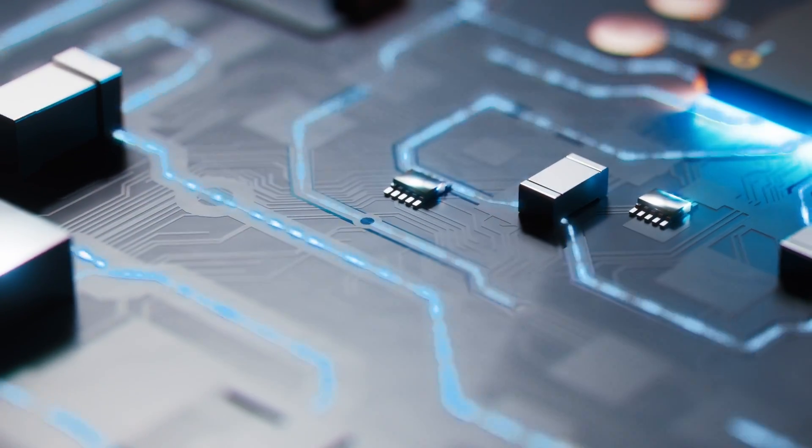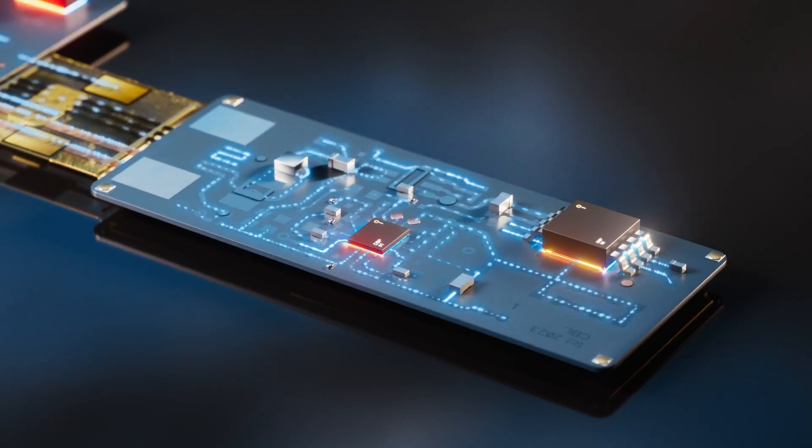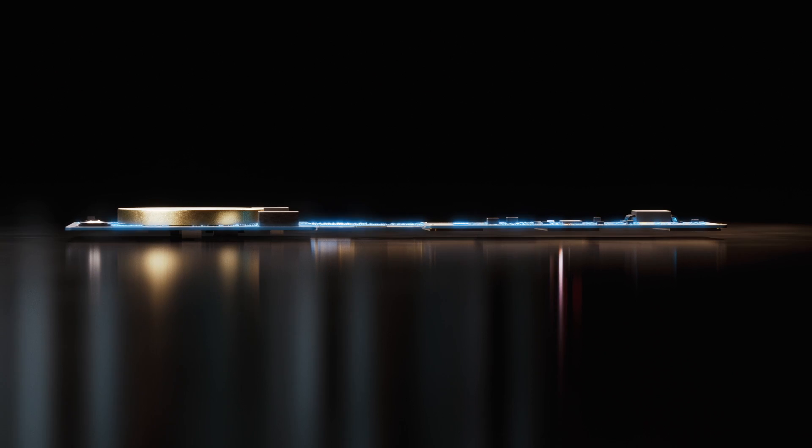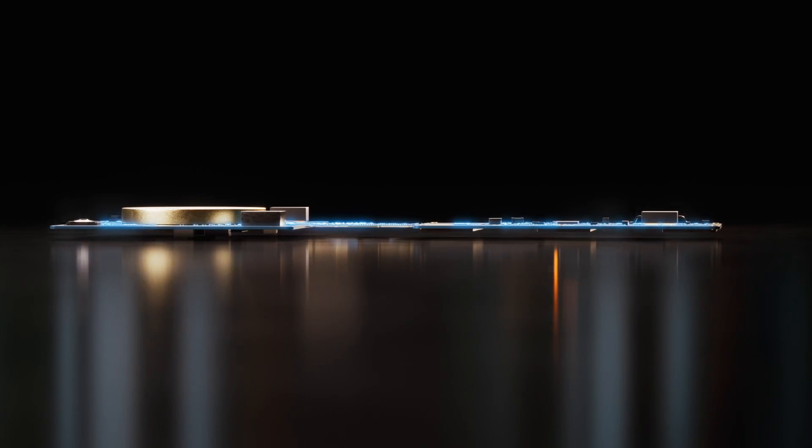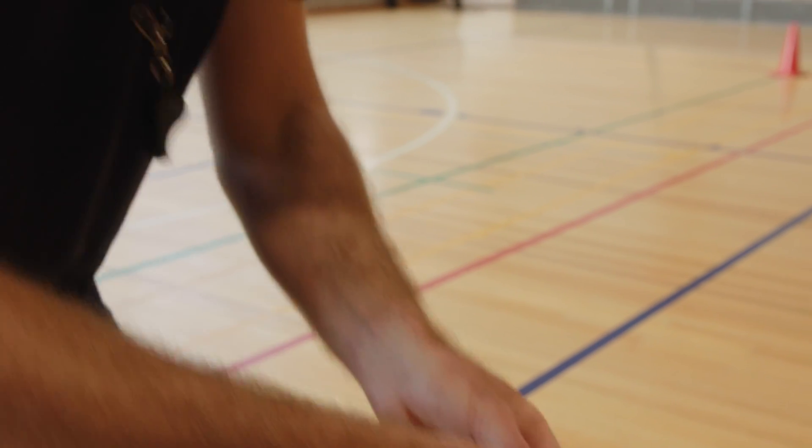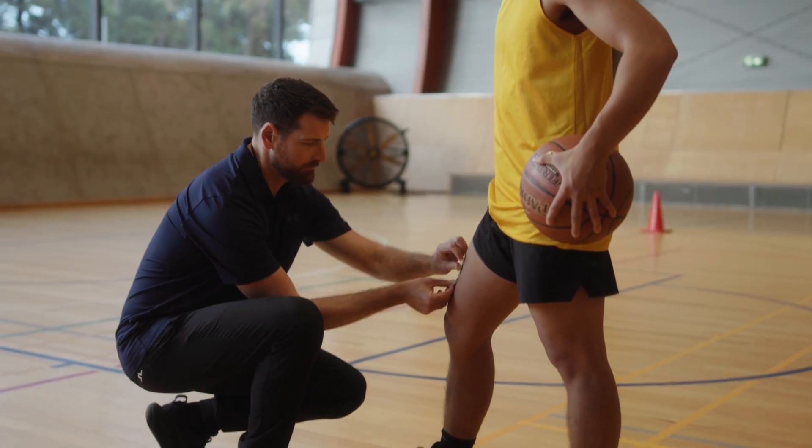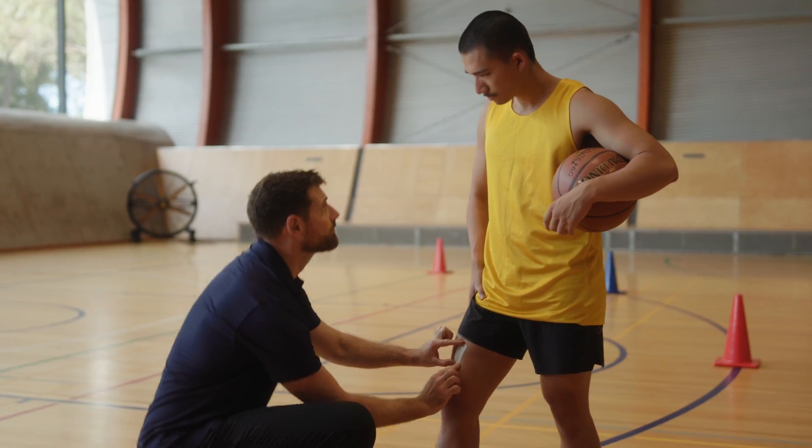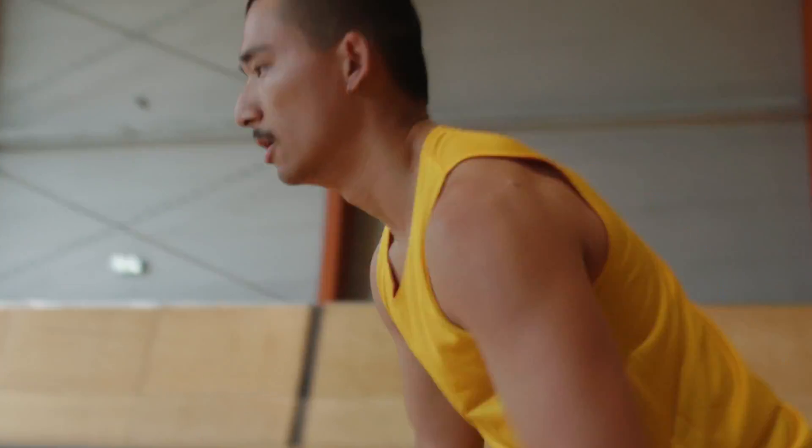The NeuroStrip brings unprecedented flexibility and accuracy to EMG devices. Unlike other devices that are restricted to a wrist or connected to external electrodes, the NeuroStrip weighs only 3 grams, is as easy to apply as a band-aid, and can be placed at almost any point on the body.